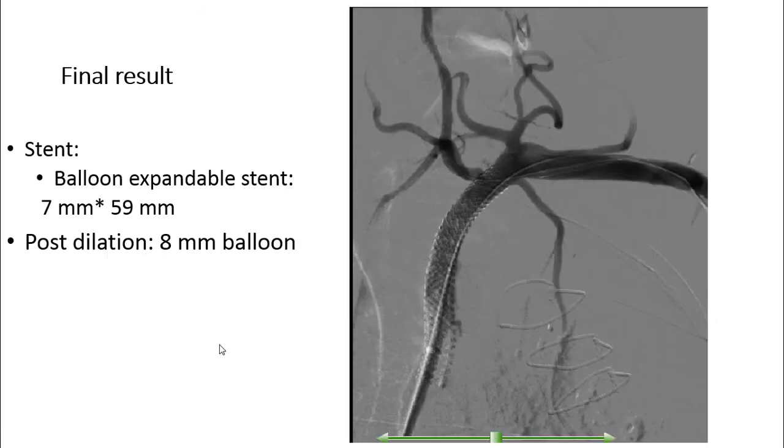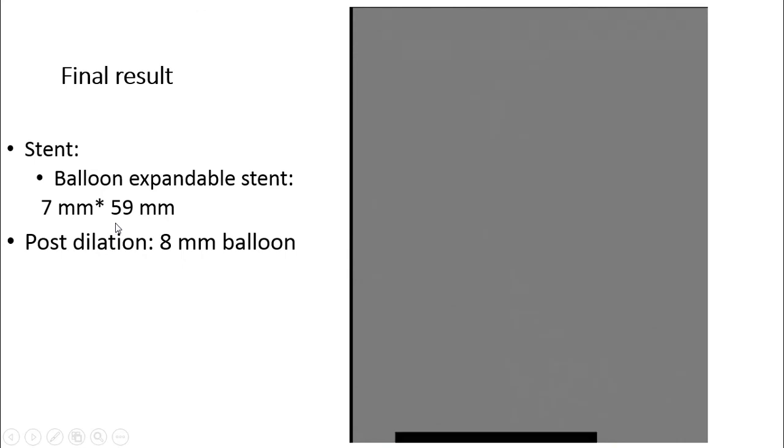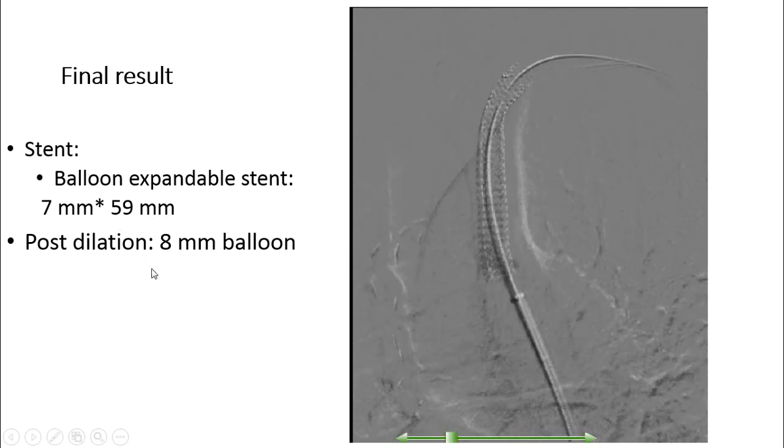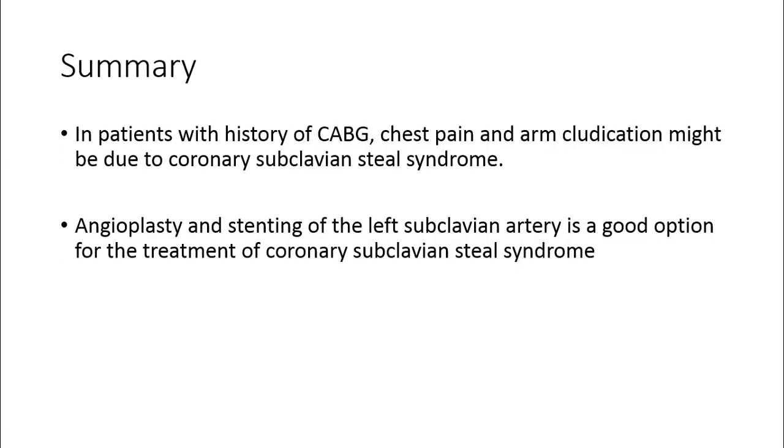We placed a stent just before the left internal mammary artery, covering the left vertebral artery down to the aortic arch with 2 mm into the aorta. You can see the result. Our stent was a balloon-expandable stent, 7 mm in diameter and 59 mm in length. We performed post-dilation with an 8 mm balloon, and you can see the final result.